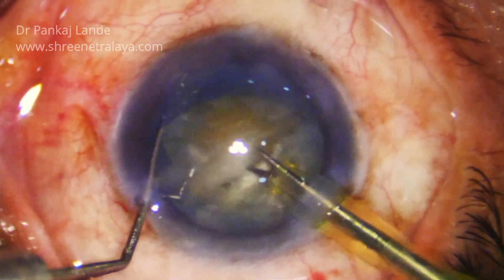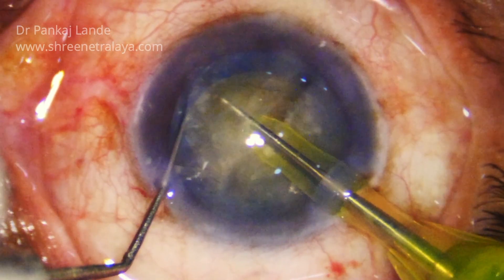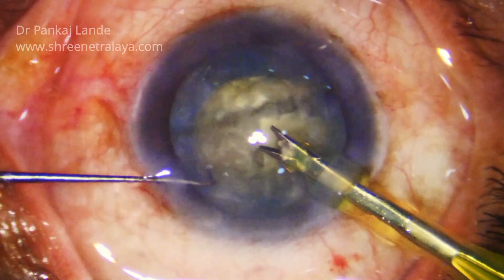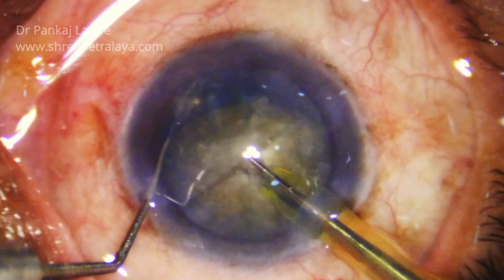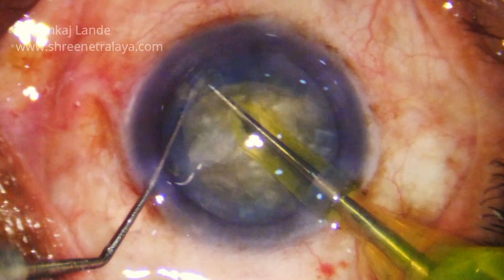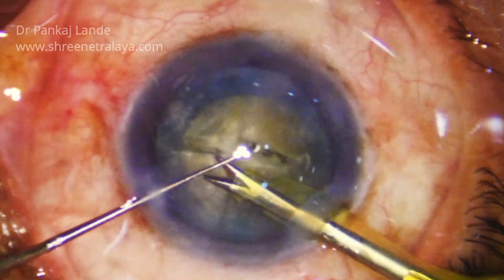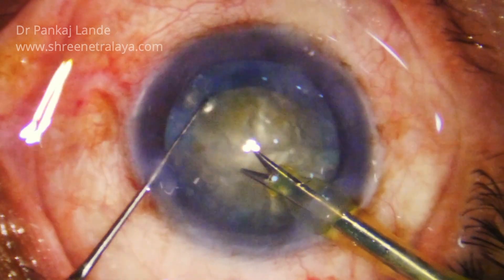Again rotate the nucleus in orientation so that you can start to have a second pre-chop. Here you get your second pre-chop. Going under the CCC is quite difficult for few people but with practice you can do it. Start rotating your nucleus before FACO so that you will get used to this step. All these four pieces are done.